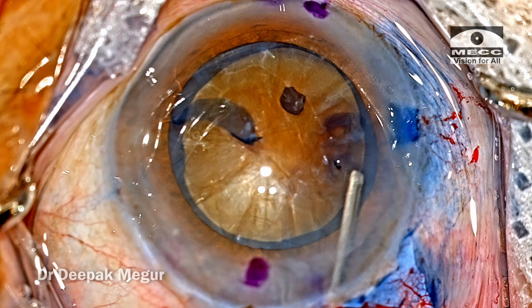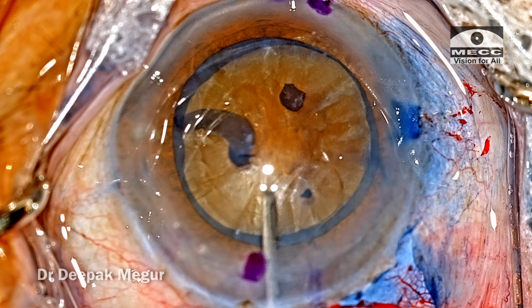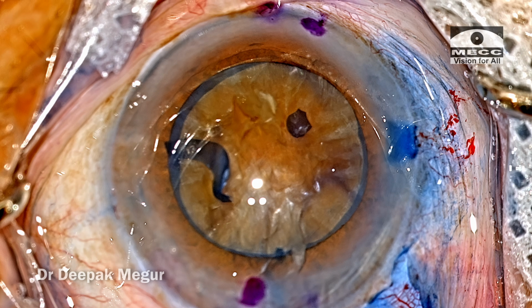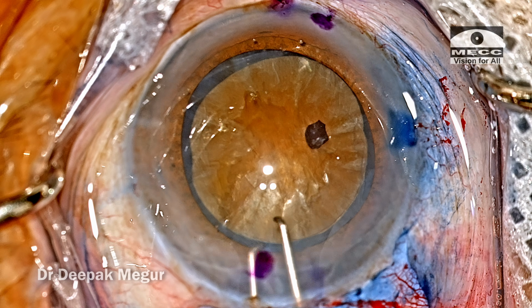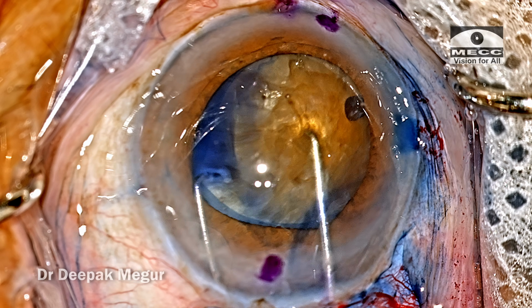It has to be very gentle because there is hardly any cortex. We just want to break any cortico-capsular adhesions, which will be very common in these long-standing hypermature cataracts. Decompress the bag. The chamber is filled with OVD. Using 2 Sinskey hooks, the nucleus is wheeled out of the bag using the bimanual wheeling out technique.